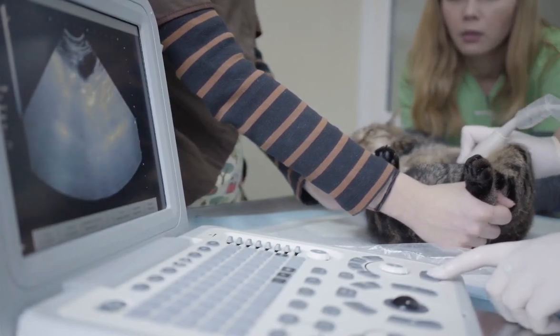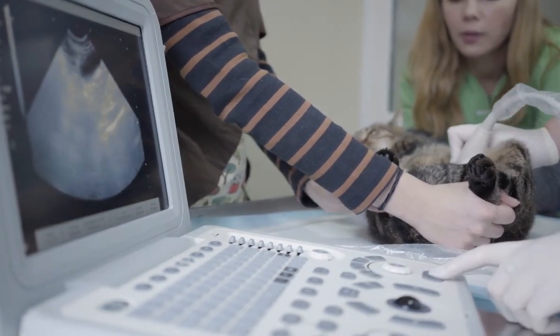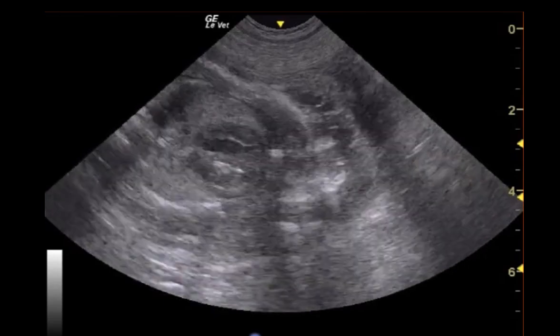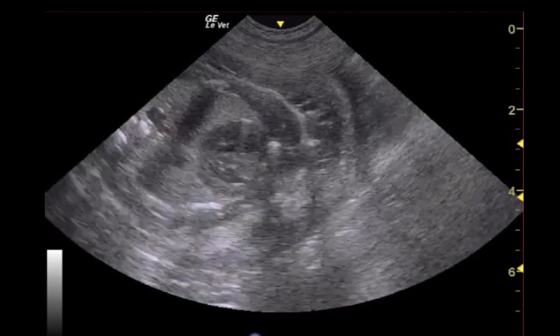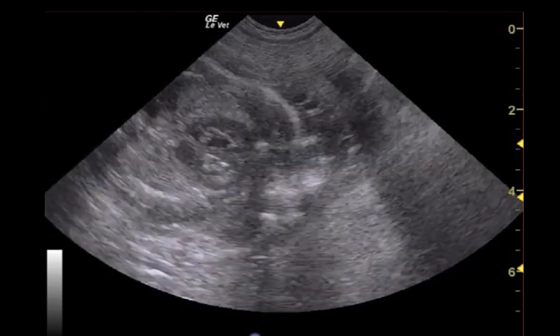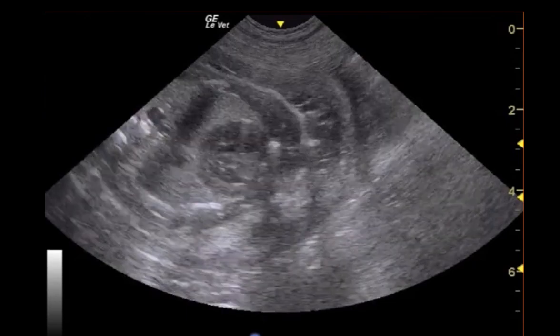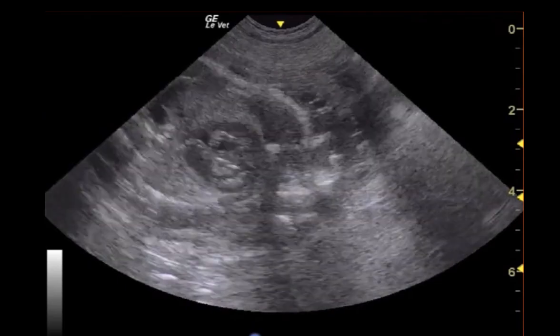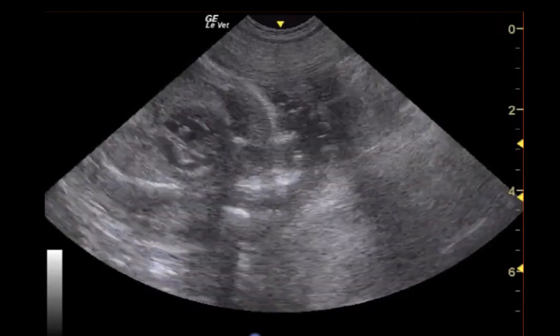The most accurate way to determine the fetal heart rate is to image the fetus with point-of-care ultrasound. One of the biggest challenges is accuracy, because if you're just trying to do it subjectively by looking at the beating heart and counting heartbeats per minute, it may be extremely hard if the heart rate is 160, 180, or greater. Therefore, the most accurate way is to use M-mode, which I'm going to teach you during this video.